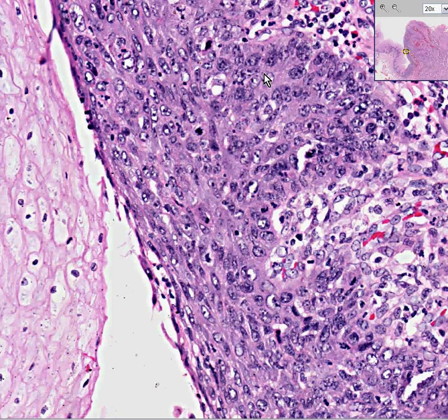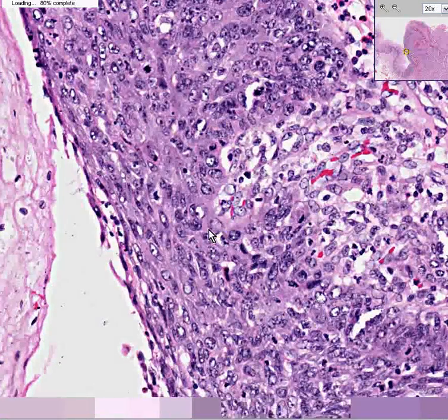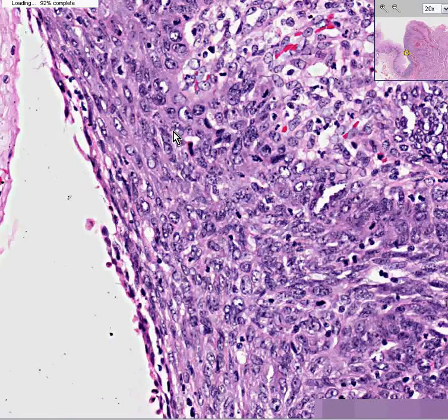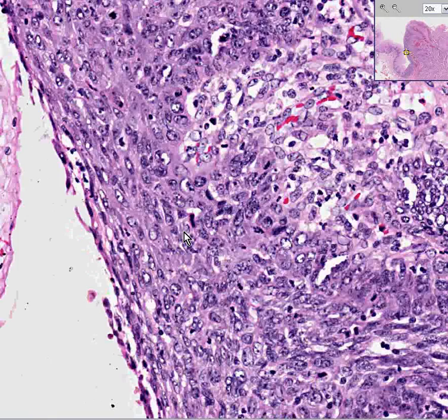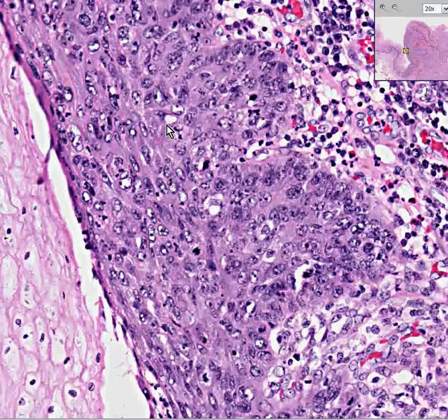And whereas you might say, well, maybe a little bit, these cells might mature from the base, flattening out a little bit towards the periphery. They are dark, big, lumpy, irregular cells, mitosis all over the place. Some of the mitoses are what they call tripolar or multipolar, which means they're trying to go in more than two directions, which is almost always a sign of malignancy.